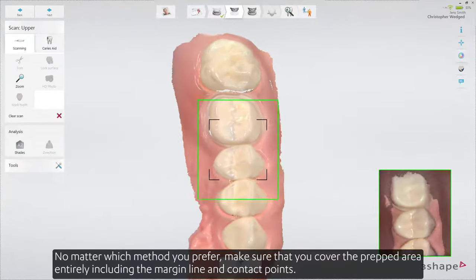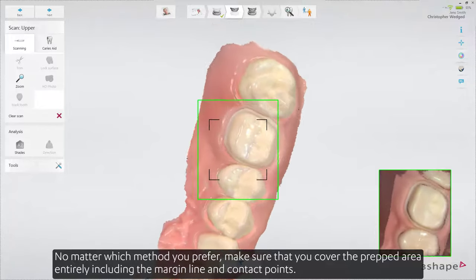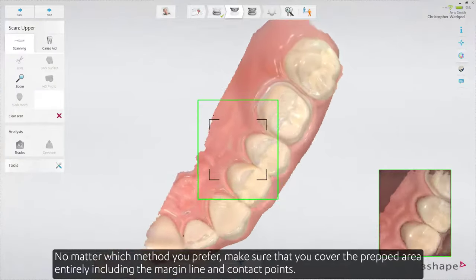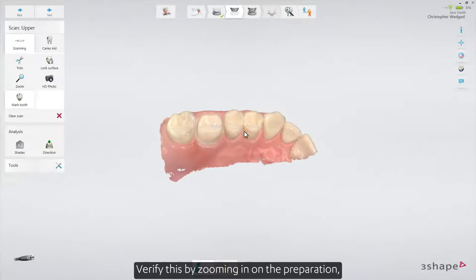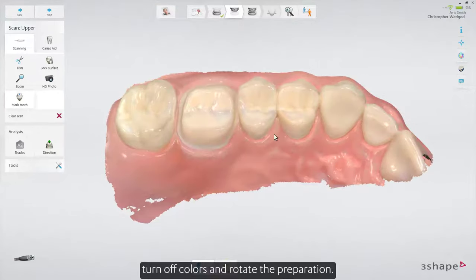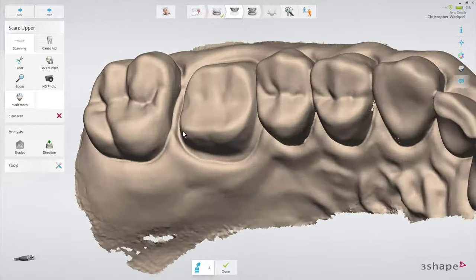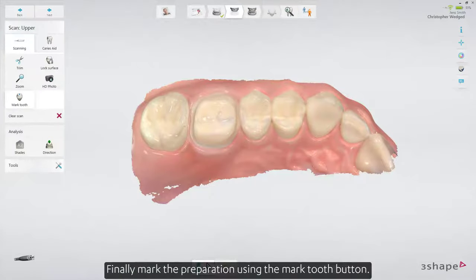No matter which method you prefer, make sure that you cover the prepped area entirely, including the margin line and contact points. Verify this by zooming in on the preparation, turning off colors and rotating the preparation. Finally, mark the preparation using the mark tooth button.